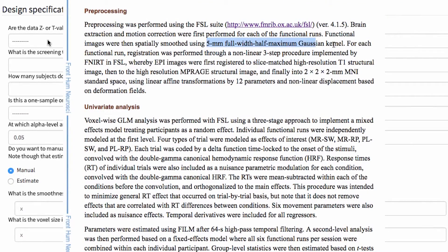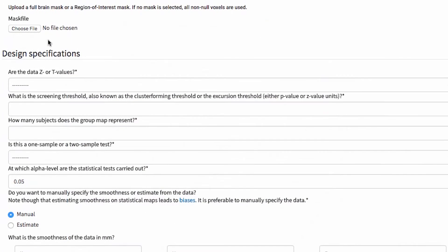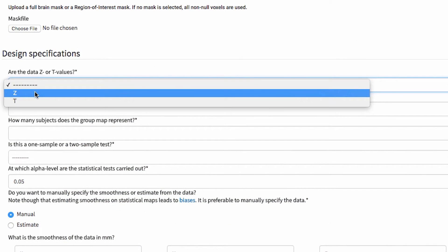And lastly, what is the smoothness of the data in the X, Y, Z directions, and the voxel size in the X, Y, and Z directions? In this case, we know that they smoothed with a five-millimeter smoothing kernel. We also know that the final smoothness is probably going to be significantly greater than that. For right now, I'm just going to put in an estimate of eight in every direction. Also, we know that the voxel size is two by two by two.